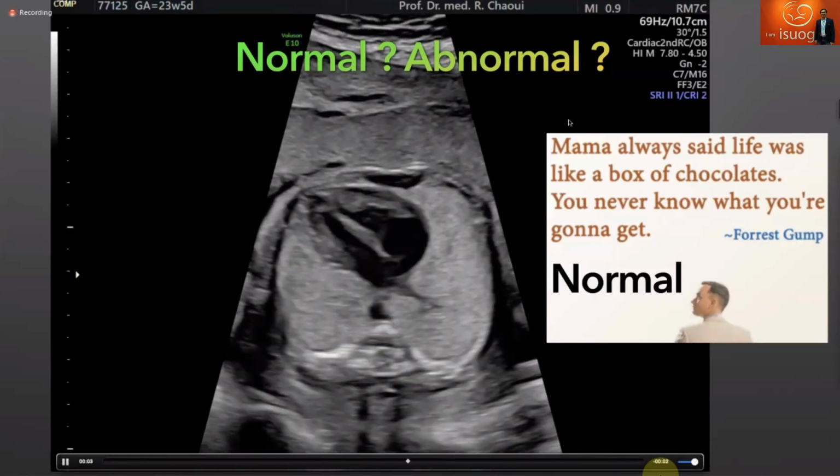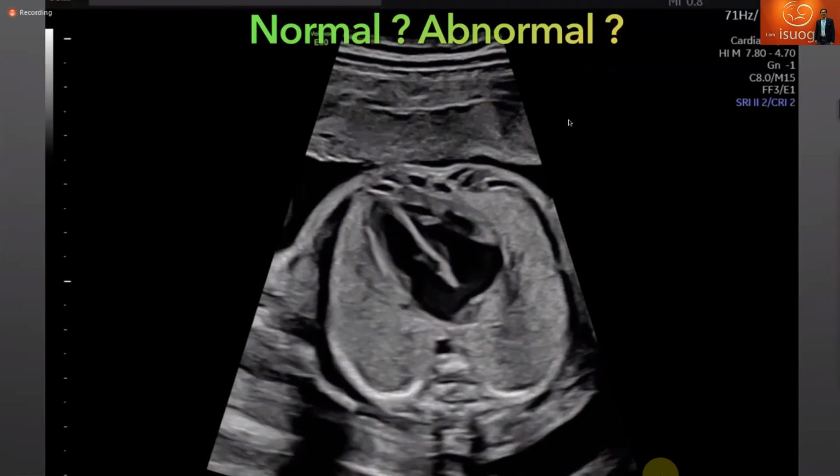Let's take another case. Is it normal or abnormal? Another one to have a break.